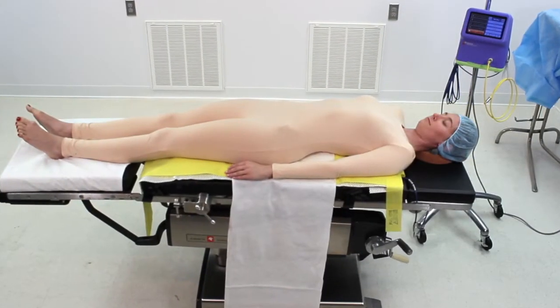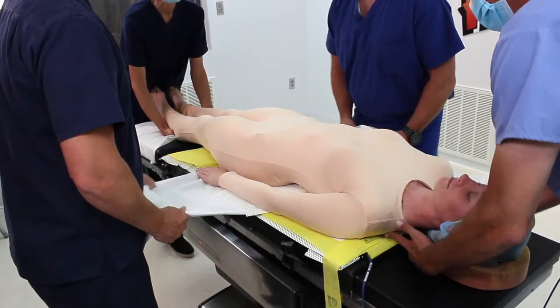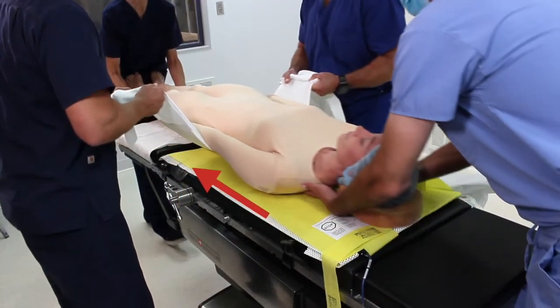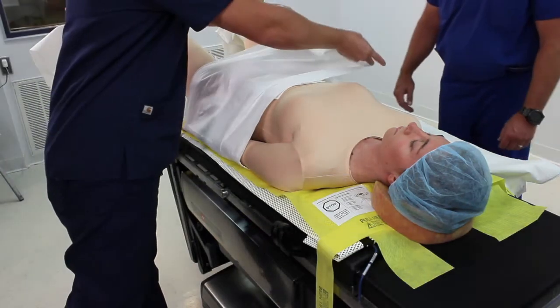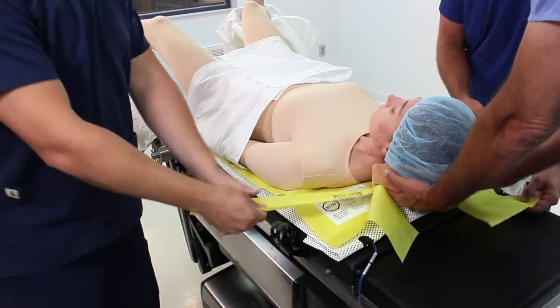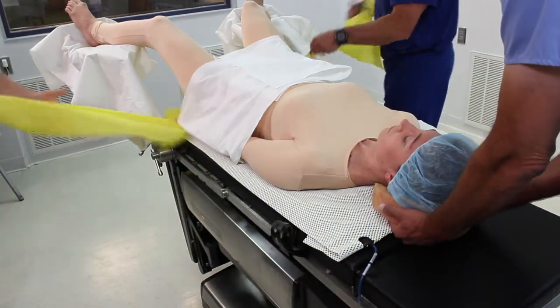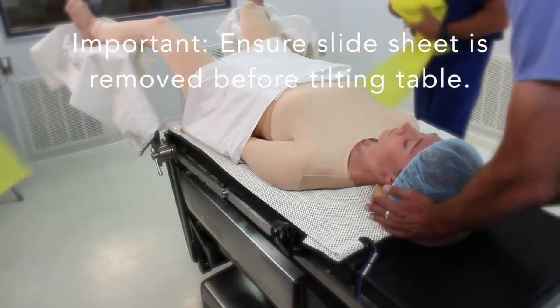During prep, the patient should lie on top of the slide sheet and draw sheet. To reposition the patient for lithotomy, one person on each side of the table must grab the draw sheet securely with two hands to provide light upward pressure and carefully slide the patient down the table. Once the patient is properly positioned, place the draw sheet ends over the patient for slide sheet removal. Remove the slide sheet by pulling on the two tabs at the head end — the perforation on the slide sheet will allow for an easy tear down the middle. It is very important that the slide sheet is completely removed prior to tilting the table, or serious injury could result from slipping.